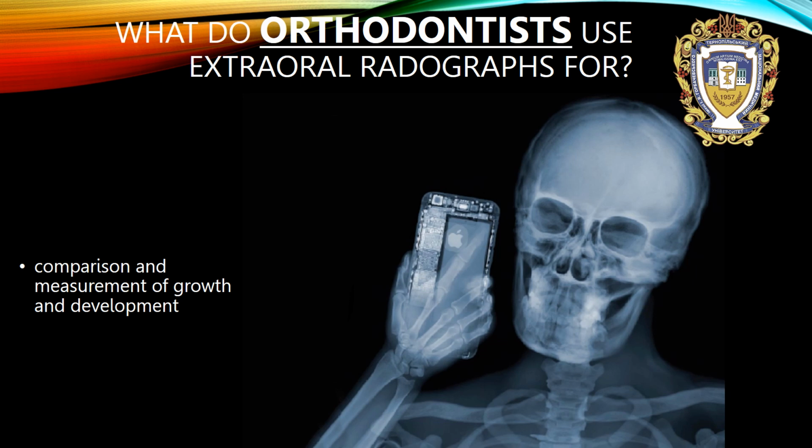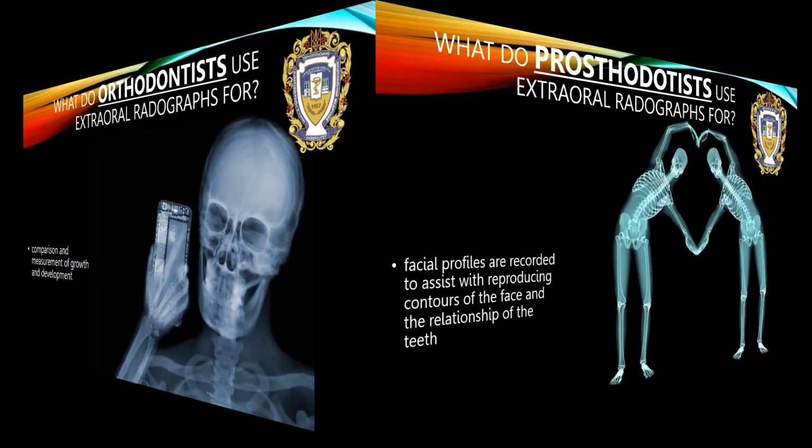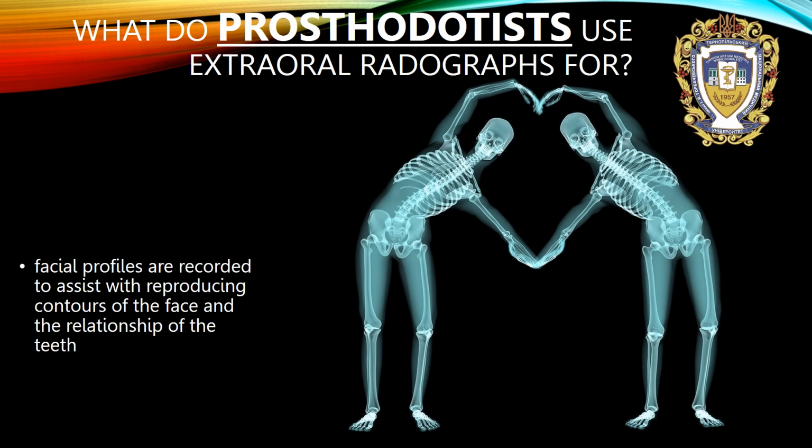What do orthodontists use extraoral radiographs for? Orthodontists use extraoral radiographs for comparison and measurement of growth and development. What do prosthodontists use extraoral radiographs for?